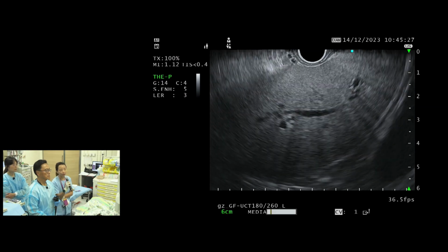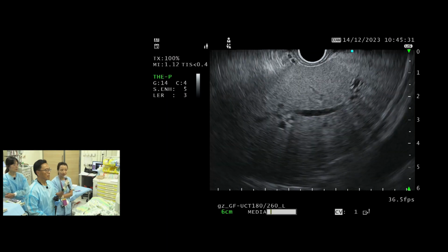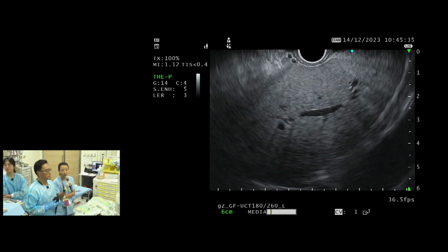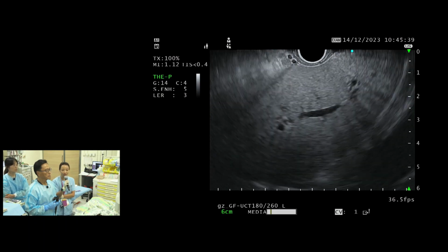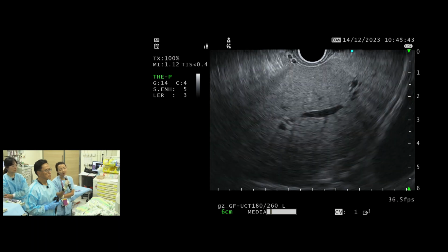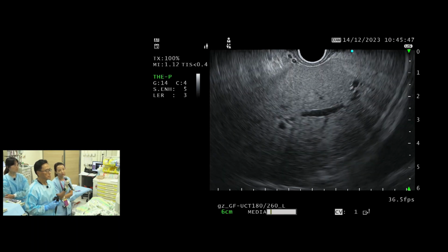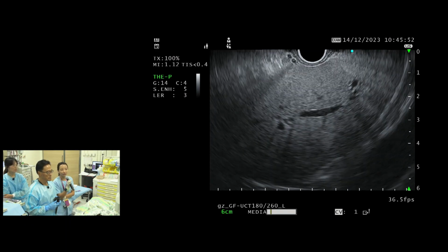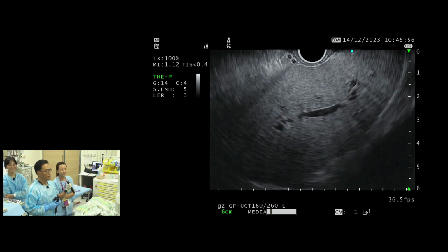For all patients with a cirrhosis-induced variceal bleed, we band it first, and then we measure the portal pressure, and then we prescribe beta blockers, and repeat the portal pressure in 3 months to see if the beta blocker actually makes any difference. So hopefully it's in line with Professor Chang's idea of using this as a parameter to titrate the beta blocker. Maybe we'll have more evidence by the end of next year.